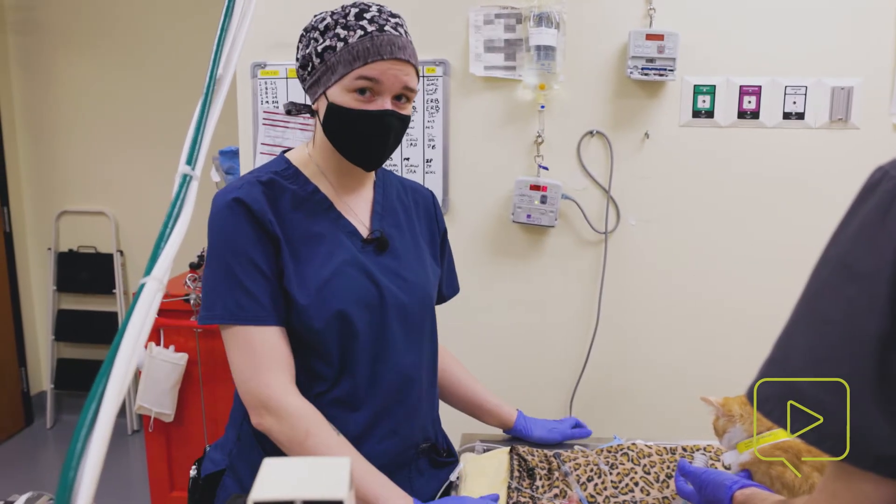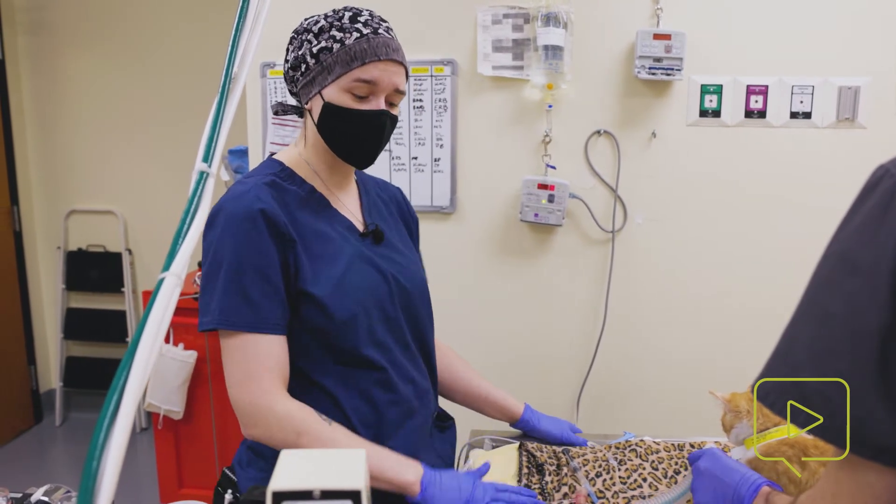Hi there, my name is Mayna. I'm one of the surgery technicians at Dove Lewis and today we're going to review how to intubate a cat.